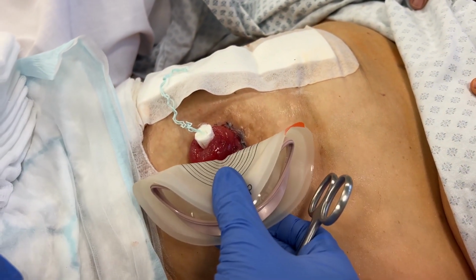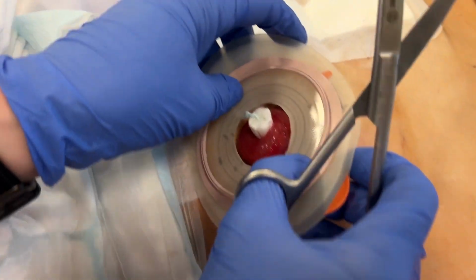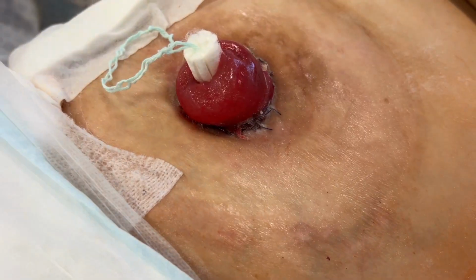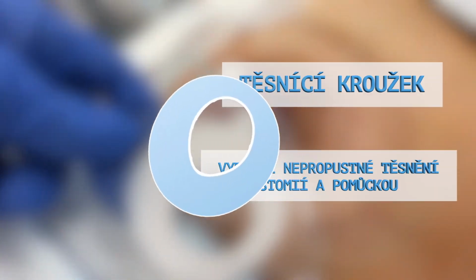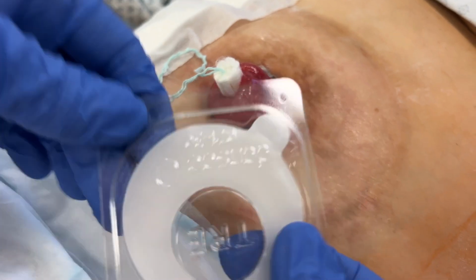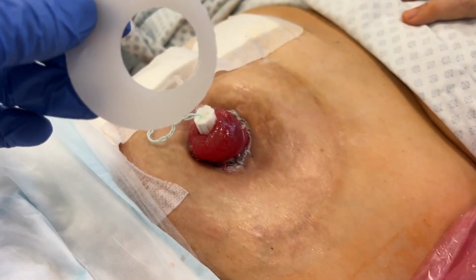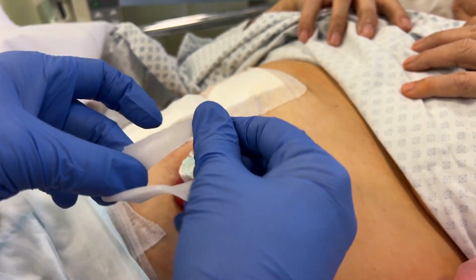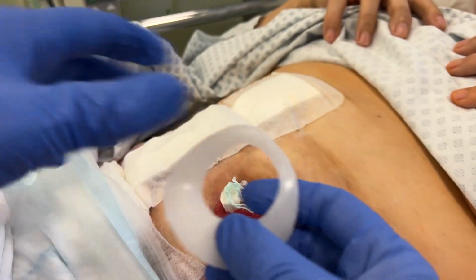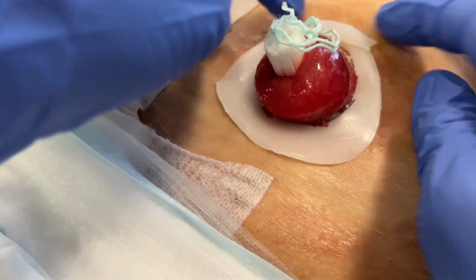In the selected appliance, we measure and cut an appropriately sized opening. By placing the appliance, we verify the size of the cut opening, which we can further adjust if necessary. The sealing ring adheres on both sides. It serves as a seal and compensates for any irregularities around the stoma to prevent leakage of waste under the appliance. The ring can be freely shaped and adjusted to fit the stoma. We place it and gently press it to ensure proper adhesion to the skin.